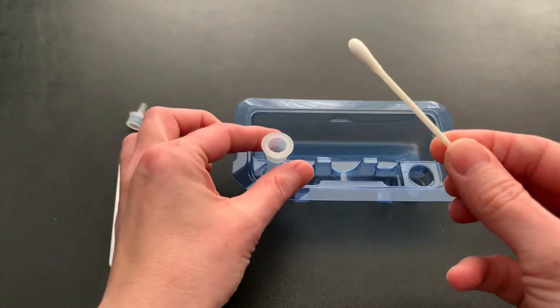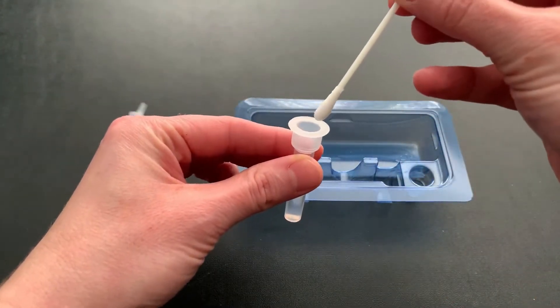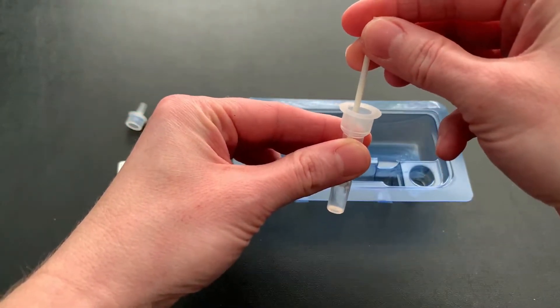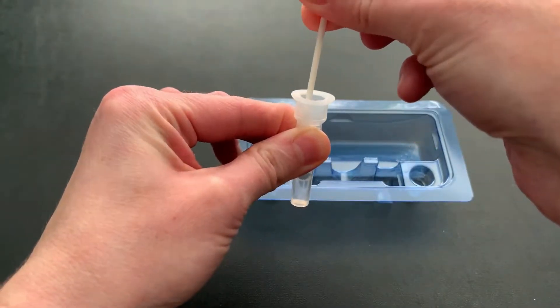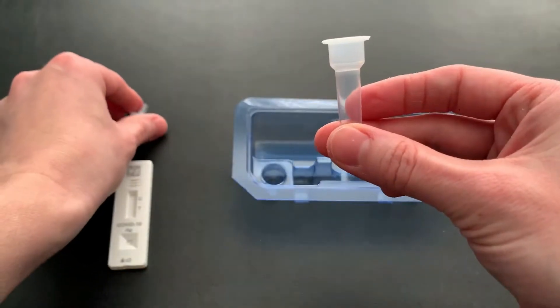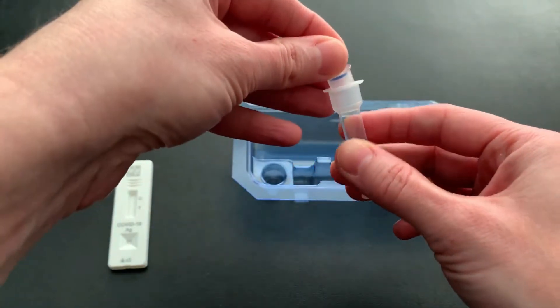Take the swab out and go ahead and place it into the extraction vial. Then rotate it at least five times around. When you're all done, remove the swab by rotating it against the extraction vial while squeezing the sides to make sure you release all of that liquid. Go ahead and close it up, take the cap, and push it firmly on there.